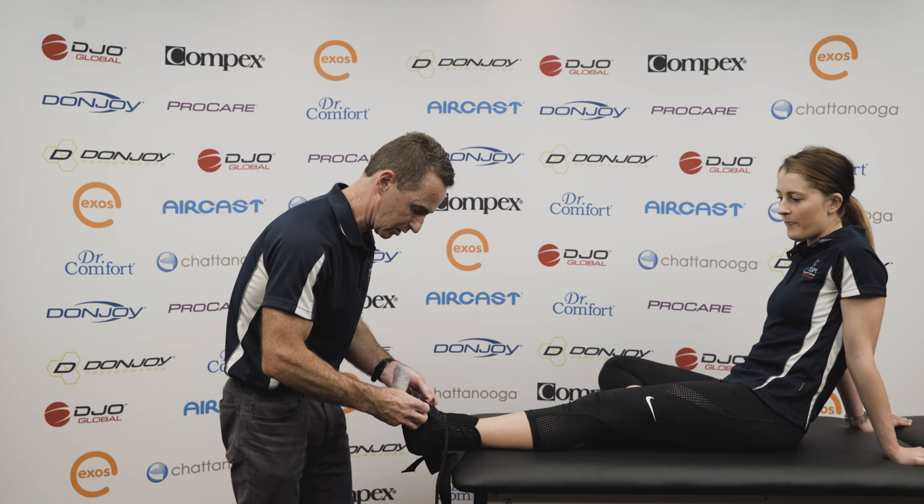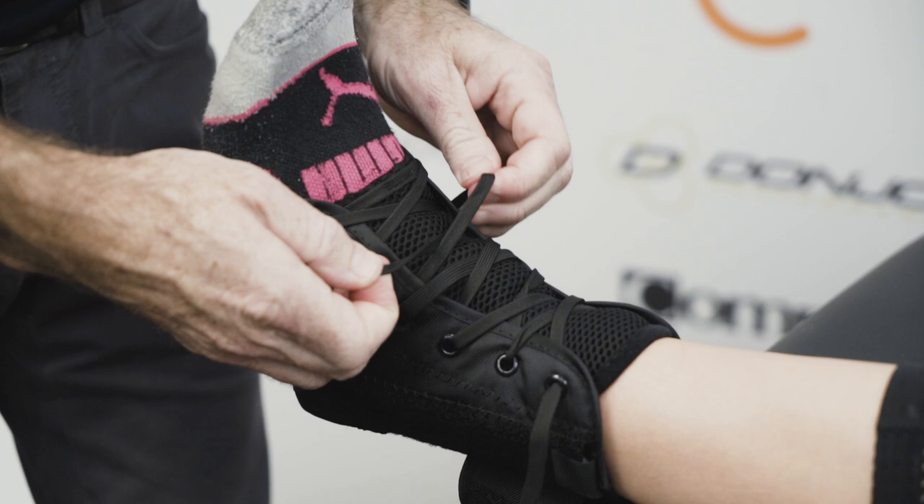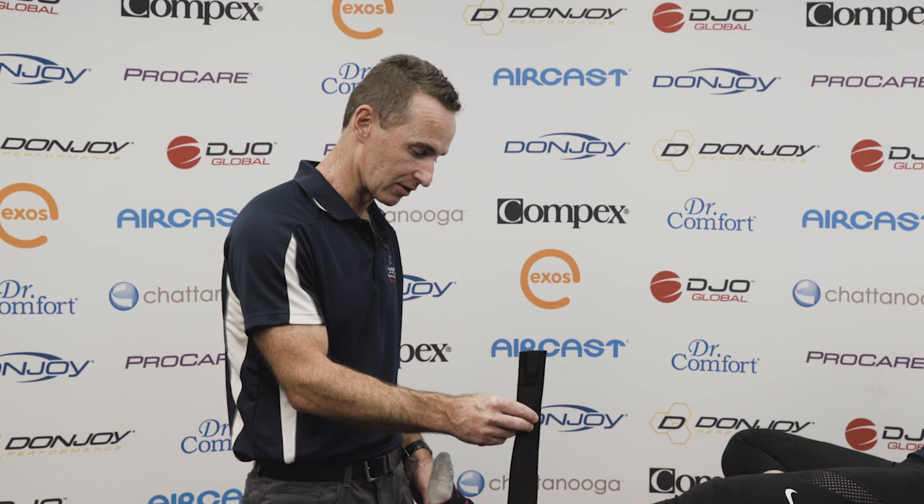Once the brace is on, we're going to do it up with a firm pressure exactly as you would your normal shoe. So the laces go up first.